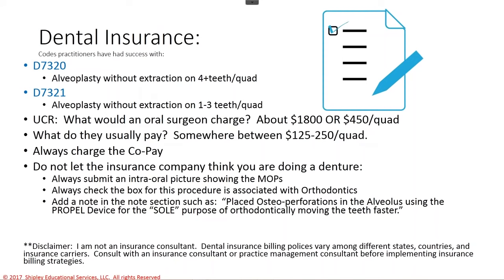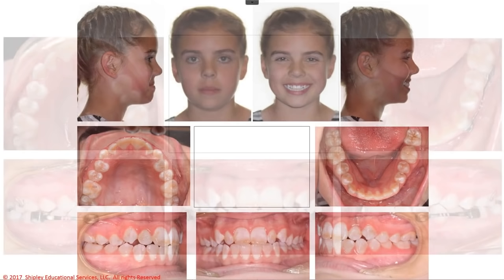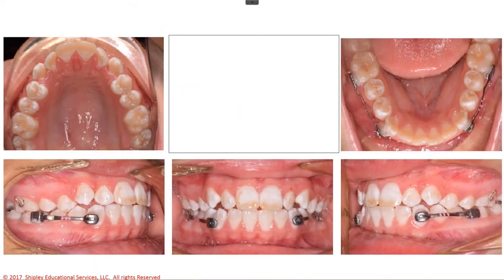So this is the final case that we're going to finish with. This patient is a class 3 case. This patient came in because the parents were in the dental industry. They knew about Carriere Motion Class 3 on this class 3 case. They knew about MOPS. They knew about VPro 5. They knew about Invisalign. They came asking for all 4 of those. So here we are with the Motion Class 3. Don't have time for a whole lot of details here.